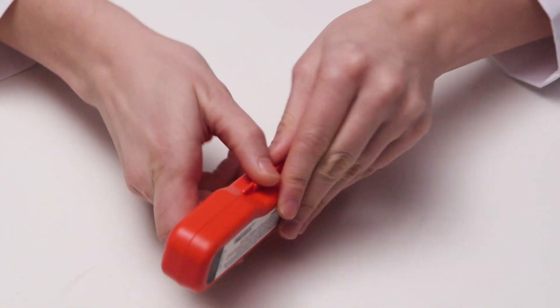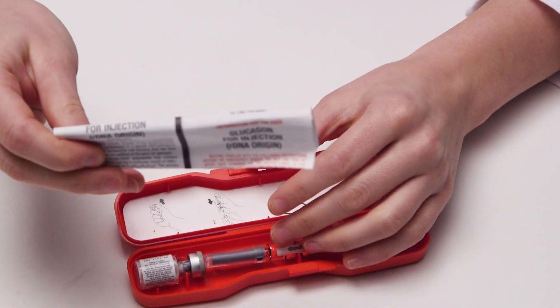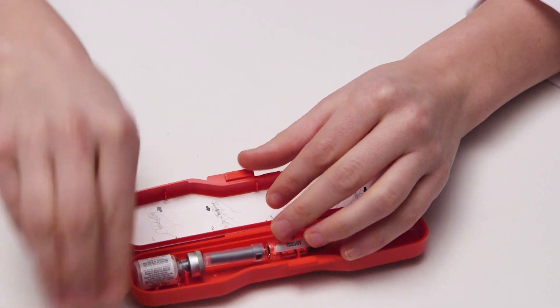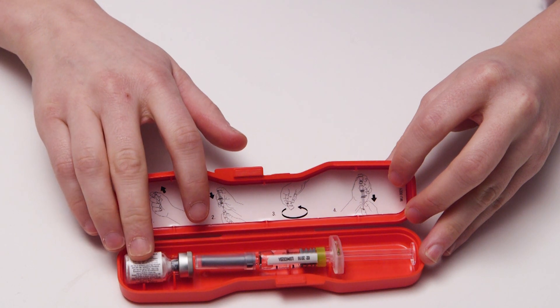Open up the glucagon kit. There are instructions inside of the kit if you need them later. Inside the kit is also a syringe full of liquid and a vial full of powder.